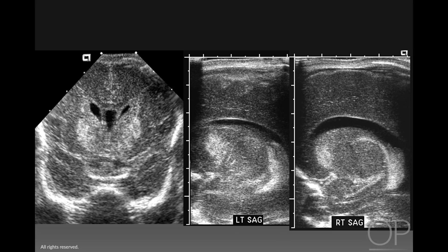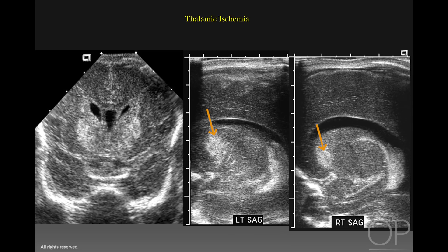Here we have a child who is approximately 30 weeks, who has symmetric bilateral basal ganglia echogenic lesions that are moderately bright. Unlike hemorrhages, they do not exhibit mass effect and do not displace normal structures. In this situation, we need to include focal neuronal ischemia. At pathology, this child had focal neuronal injury in the basal ganglia.